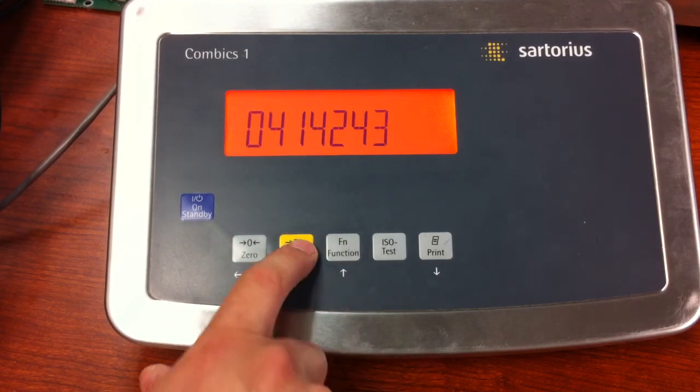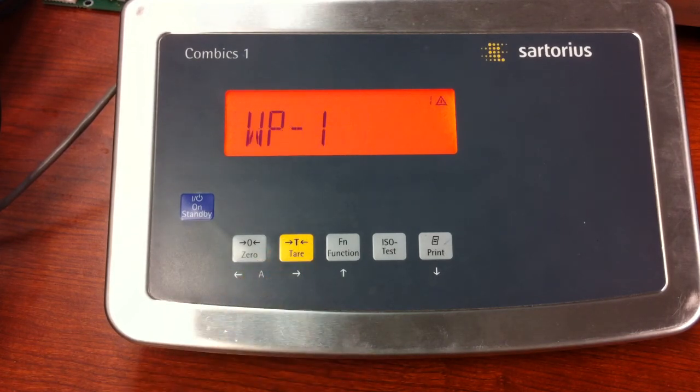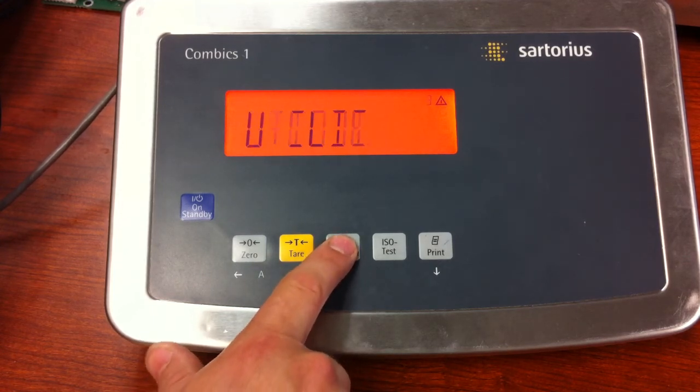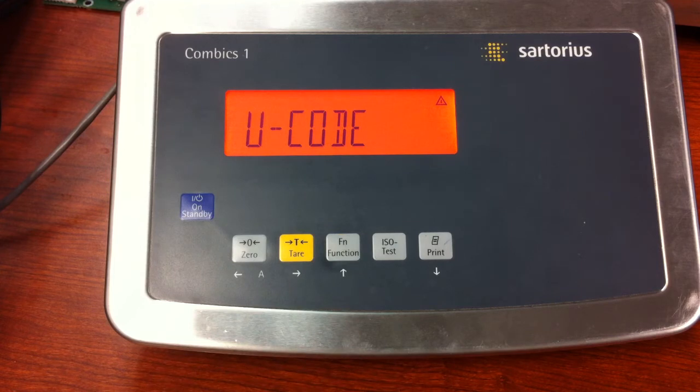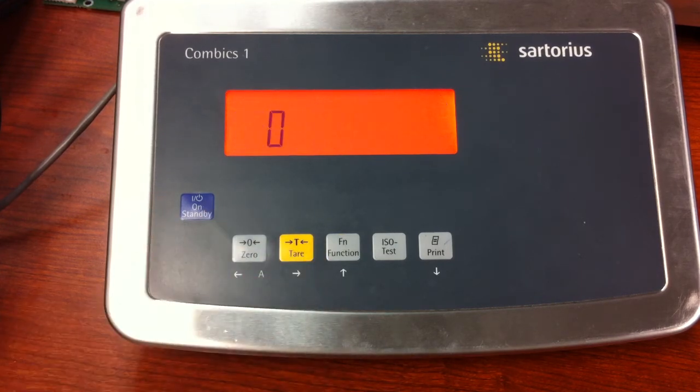Once you have your password in, press and release the tare key, then press and release it one more time. It will bring you to WP1. Function up until you see Code — this is U-code. Press the tare key on that and there's your password that was stored, maybe intentionally or unintentionally.